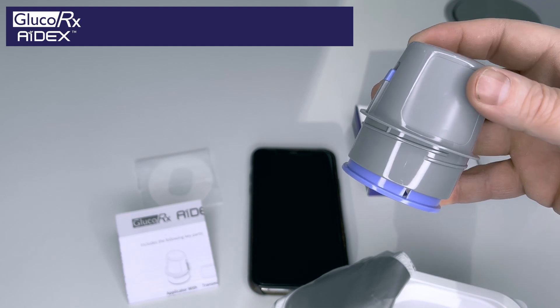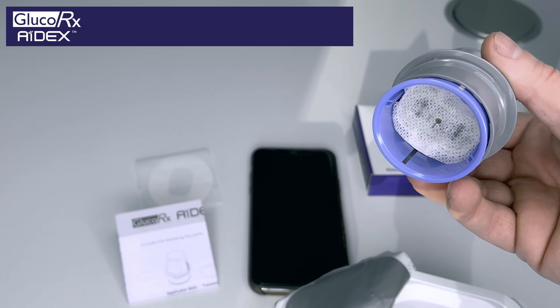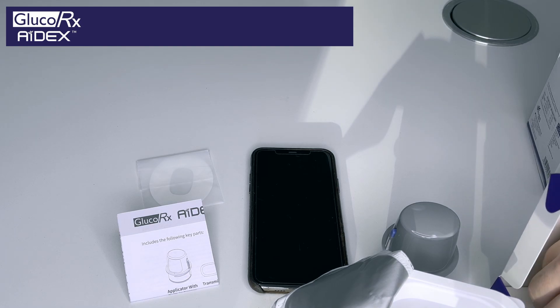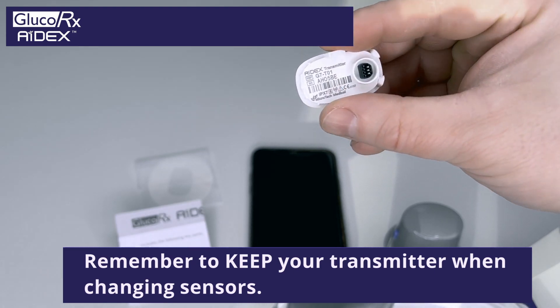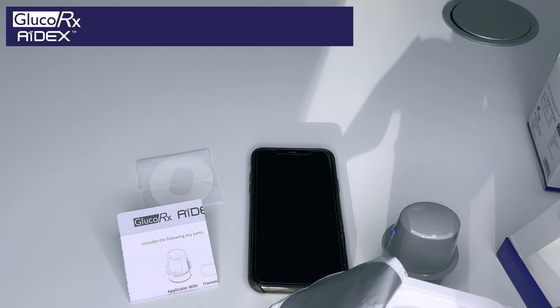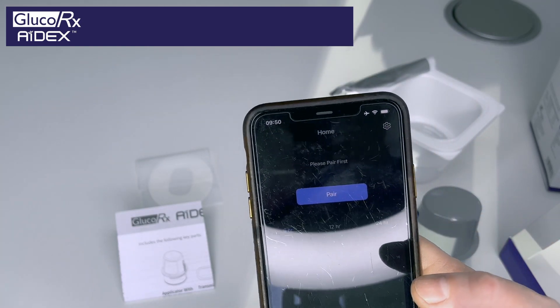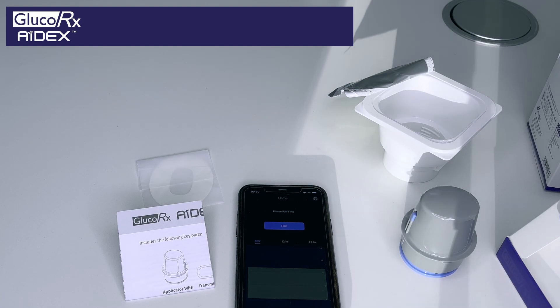You can apply the sensor either in your abdomen, lower stomach, or on your upper arm — whichever personal preference. The transmitter is very, very small, and once you've applied the sensor, the transmitter pops on top. Once you've then applied that, you go back to your smartphone and pair — just pressing pair there, and then you're pairing your transmitter to your app.